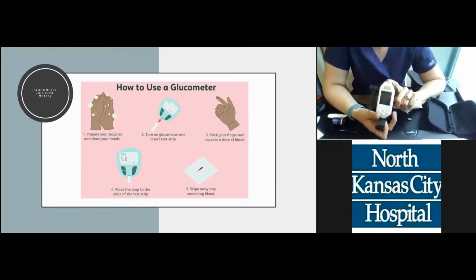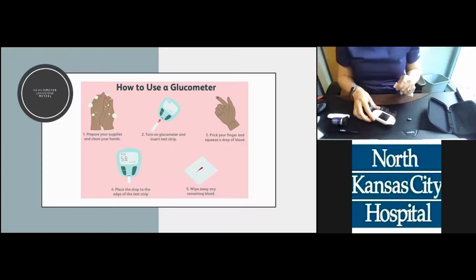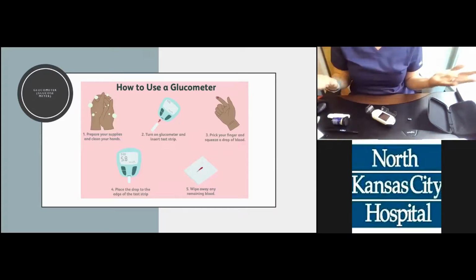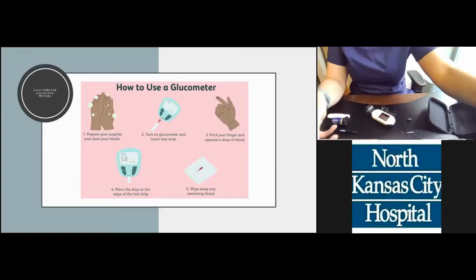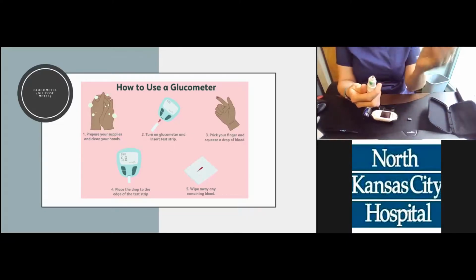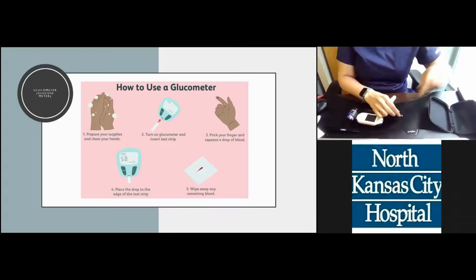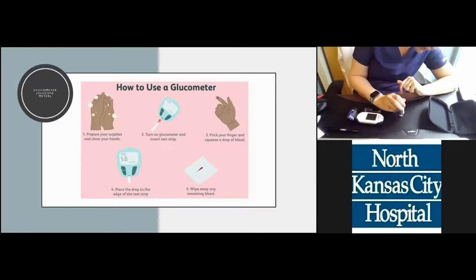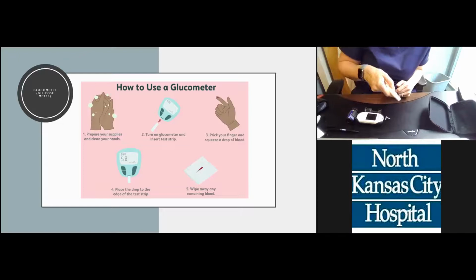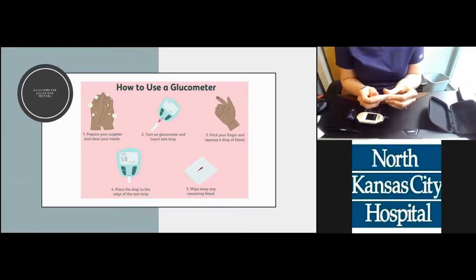And you see I took the strip out and it turned off again. Okay. So remember I said 2 hours after a meal, it should be less than 180. So I'm right in that range. Now I'm going to put all the pieces back together. I'm going to take this lancet out. And you see here was the top that I took off earlier. I'm just going to stab this little lancet in there to cover the tip so we don't have any sharp objects. Then I'm going to push it out. Okay. And then I'm going to put the cap back on, and it's ready to go.